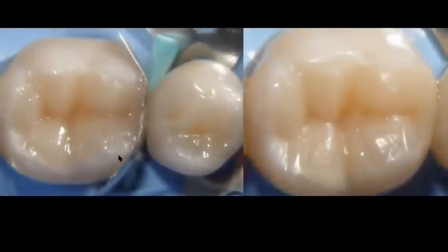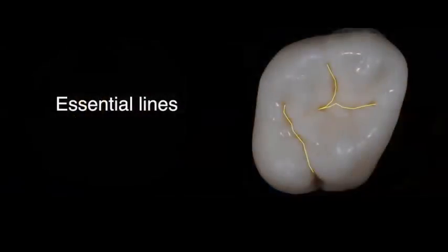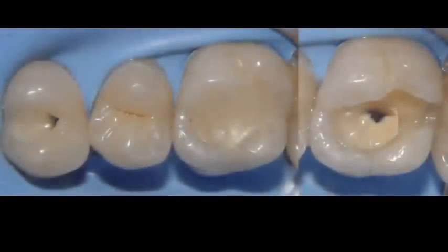This is now, we've done our proximal wall. We've done our horizontal dentin layer. Now we've built up each of the cusps one by one. You can see it right here using the explorer and the chord packer. And what we're trying to do, again, our essential lines, we recreated those essential lines in our occlusal anatomy, and we build up the tooth. We build each increment ahead of time, thinking about these essential lines so that we get the right occlusal anatomy in our final restorations. And again, we do this every time, thinking about this.